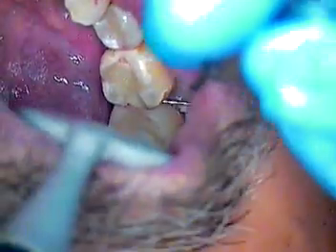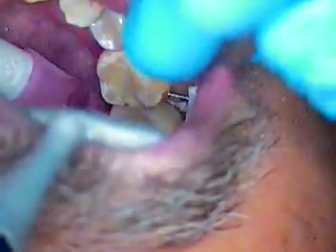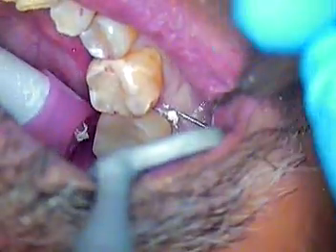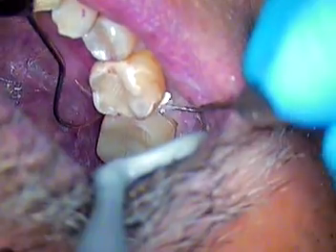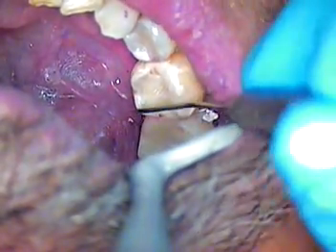We do have some cement in between the teeth to remove, and then I've got to take the cords out. There are two cords just on the mesial — and there's the rest of that material. Look at that, how nice and clean. Here comes the first cord, and I'll be careful not to go up with that. I'll just take it and pull it straight through.